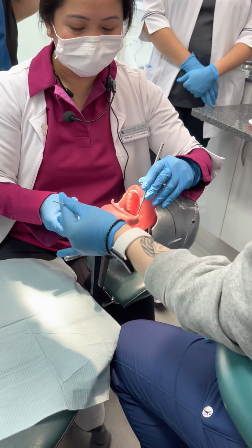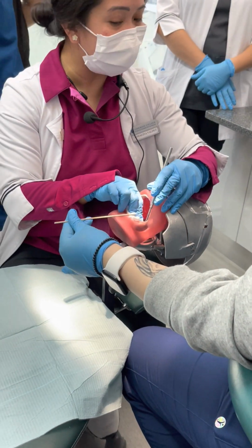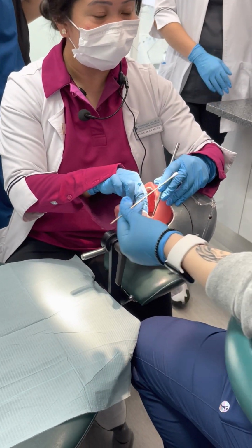With topical anesthetic to the dentist. So you have to put the gel. You have to make sure there's gel in there. Is it already in there?